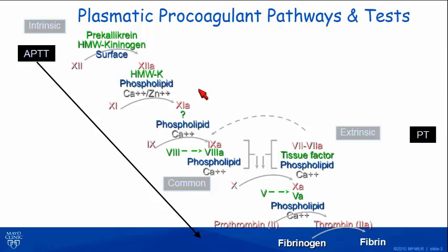The same is true for the prothrombin time, which is most sensitive to deficiencies, say, of factor 7, and least sensitive to deficiencies of things at the bottom. The endpoint of all of this, by the way, is detecting a fibrin clot and the time of occurrence of that, a rather crude methodology that we still have not advanced beyond.